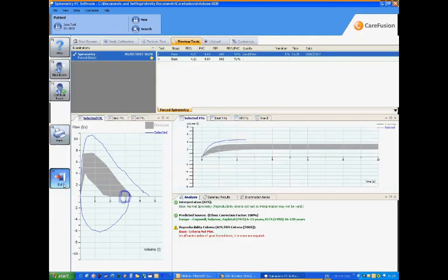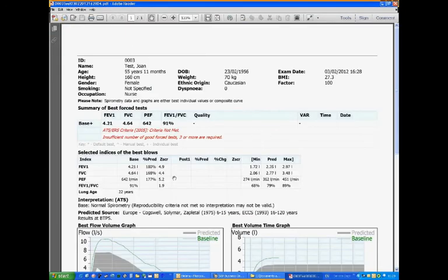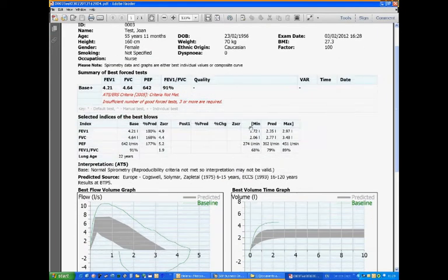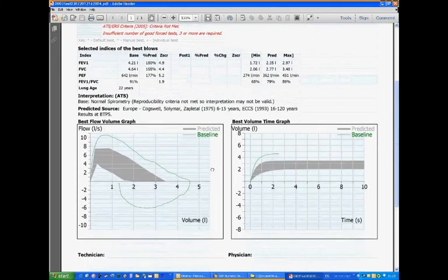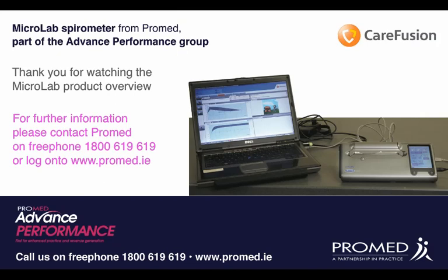We can print it off, but if we exit the software, this will actually export it to a PDF file, which can be attached to your patient management system. Thank you very much for watching our product demonstration. This is sold as part of our ProMed Performance Group. For further information, please call 1800 619 619 or see our website at ProMed.ie.